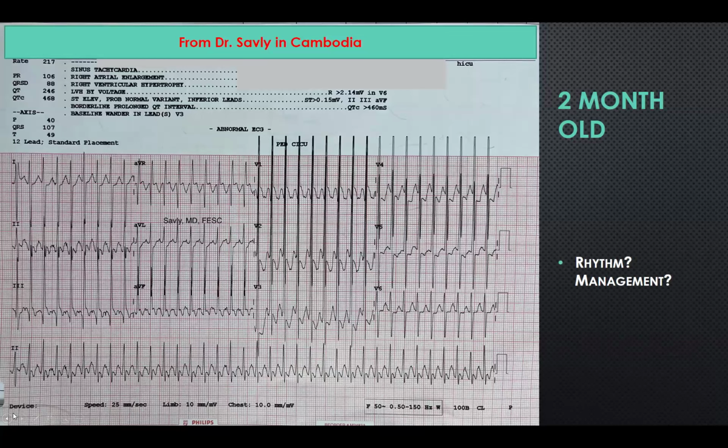The most common way that we sync on defibrillators is we use the electrocardiogram through the pads itself. And that works great. It actually turns out that the ECG on the monitor that you get through pads is usually very, very clear. But there's also an attachment I'm sure you've all seen for ECG stickers as well. You could do that as well. But you want to make sure that on the monitor of the defibrillator you do see a little spike on top of every QRS and that the device can sense properly.